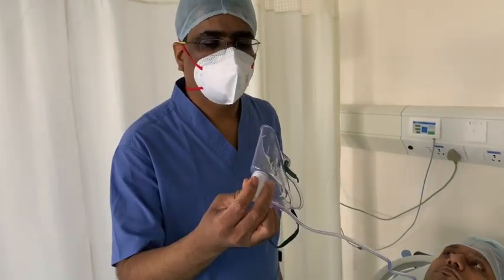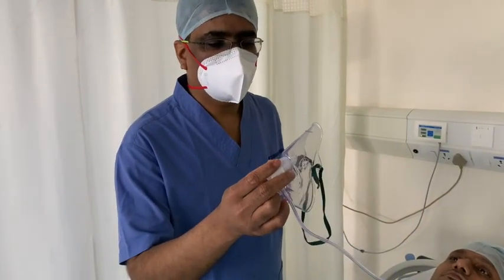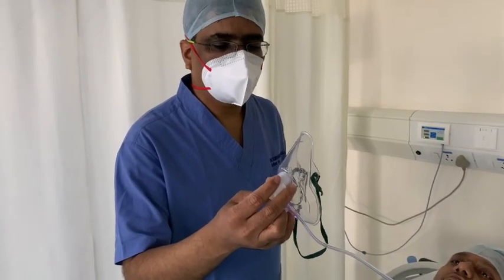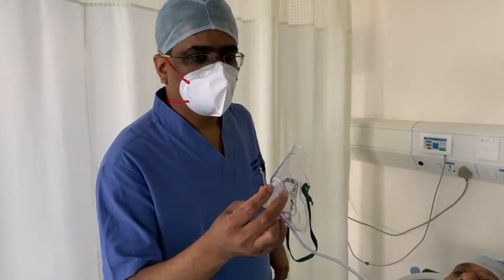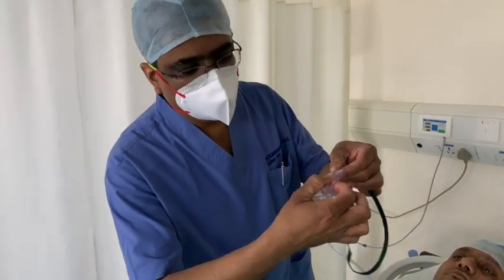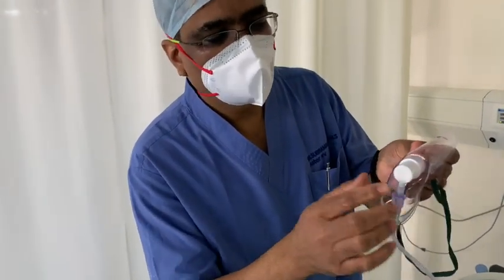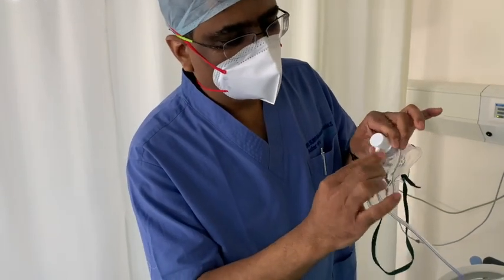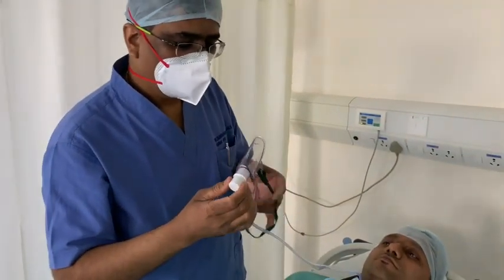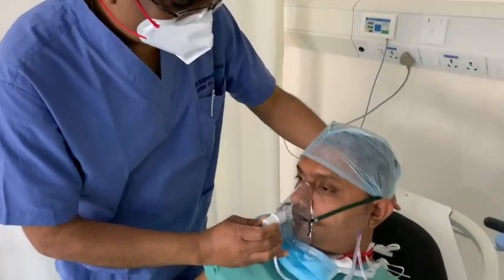The other way of giving oxygen is through this mask — a Hudson mask. This is a commonly used Hudson mask in the perioperative period after anesthesia. It has a nasal bridge here, a chin area where the jaw fits in, and the oxygen tubing is connected to the outlet port.